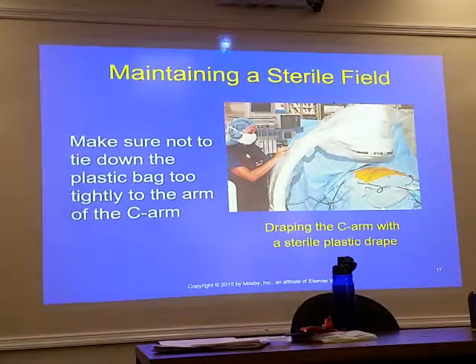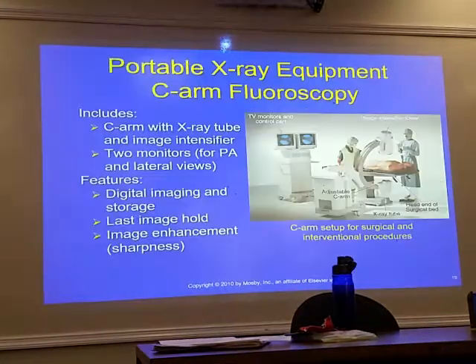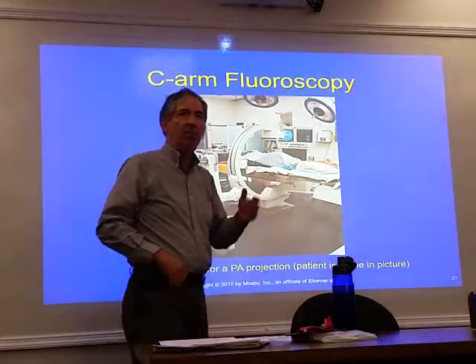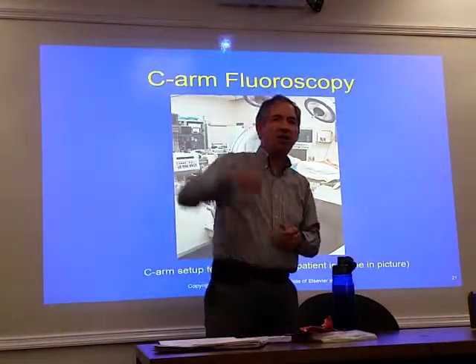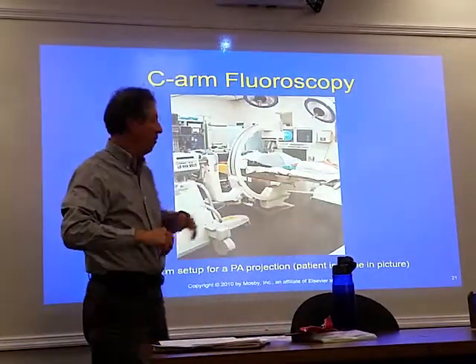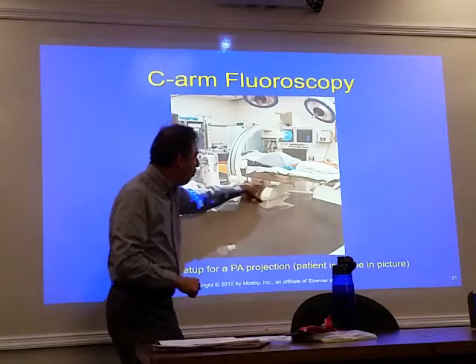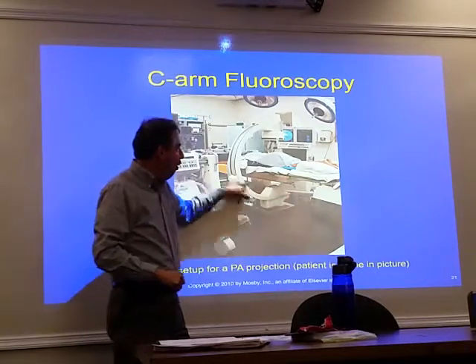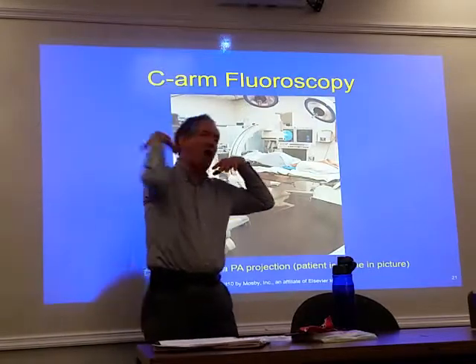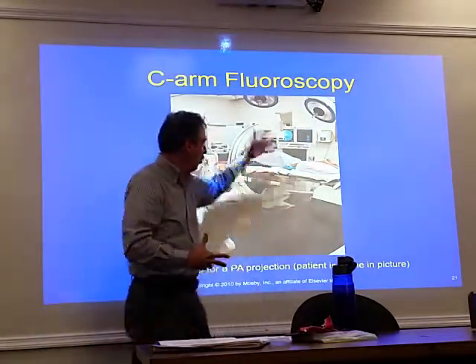One other thing, if I could make a suggestion, I'm going to kind of jump to this other slide here. What's going to help you out with cleanup here, and I know there's some people that aren't looking at the screen, so I don't know what you're looking at. So if you want to look up here, that'd be great. You might want to put some kind of baggie over the bottom, because there's all kinds of stuff, blood and all kinds of fluids that will drip down.